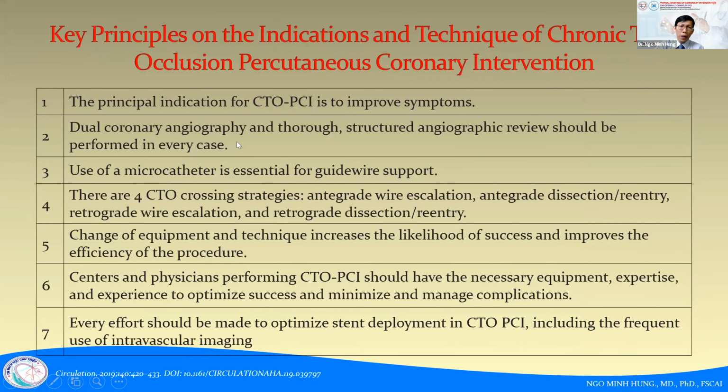So about 2 years ago, we sat together and we gave some comments in order to make a consensus on the key principles of the indication and technique of CTO PCI. So the principal indication for CTO PCI is to improve the symptoms. So if the patient has significant symptoms, we have to open the CTO.